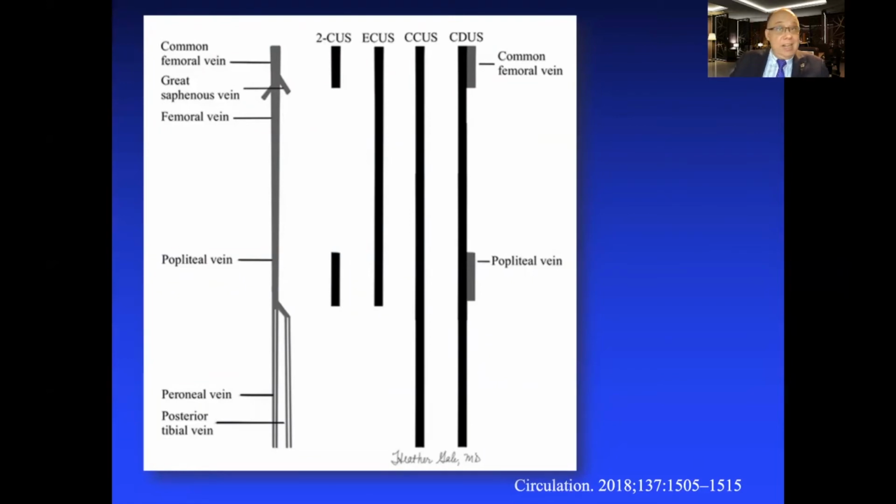And it's not necessary to use color Doppler for that. Just please do the compressive maneuver and you will be accurate in your diagnosis of whether or not there is a DVT.